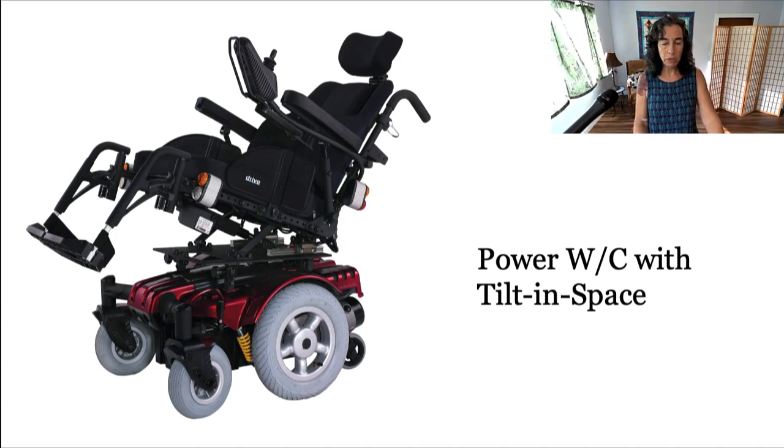Most power chairs with tilt in space cannot be driven when you're fully tilted. That's a safety feature. You don't want to be flat on your back and going forward. And the override feature locks out this drive capability. So it clicks into fully tilted and out of drive.